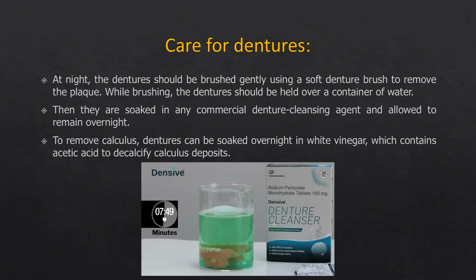Half an hour is more than enough for the cleaning of the dentures. Another thing is that even in spite of cleaning the dentures thoroughly over the years, the denture may attract calculus, tartar, and other deposits. These can be removed by placing the dentures overnight in white vinegar, the regular synthetic vinegar we get on store shelves, which helps dissolve the calculus deposits.